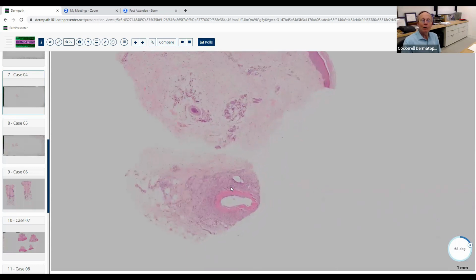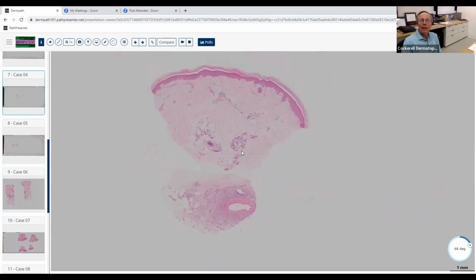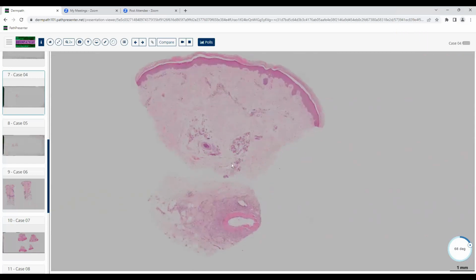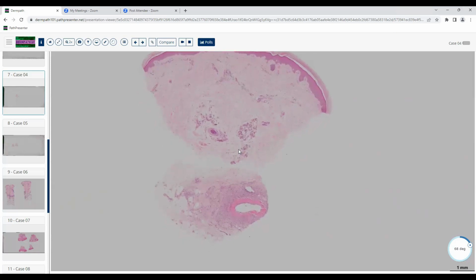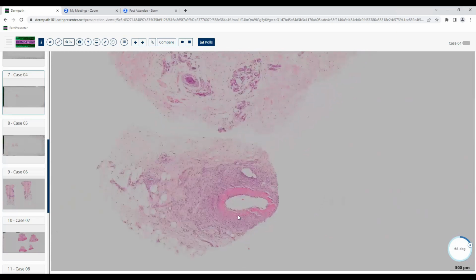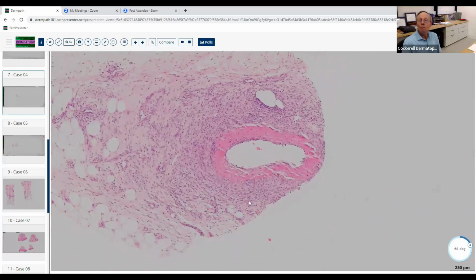Now, once we get into the category of vasculitis, we've already had one vasculitis today. If this is vasculitis, how different is this than the other one that we saw? How do you classify vasculitis when you are faced with a patient that possibly has vasculitis? What's your classification scheme? One of the first things you can do is look at the size of the blood vessels involved. So this looks a little bit larger than the early LCV one we saw earlier, so it's more of a medium-sized vasculitis. Good, very good. I agree.